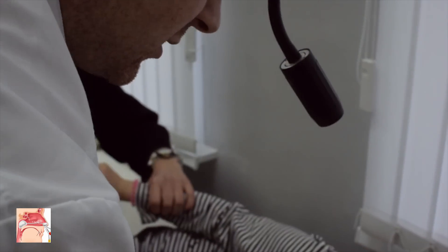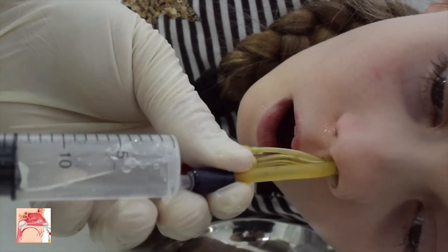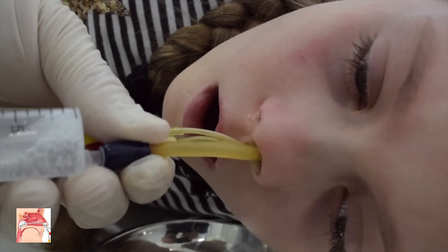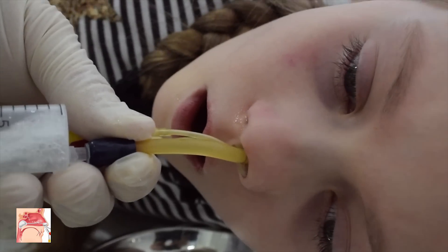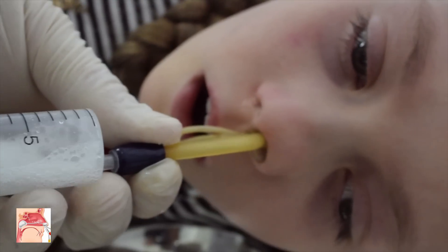For injection of the drug into the sinuses, the patient should be placed in the lateral recumbent position on the same side as the sinuses to be injected. In this position, the drug will fill the sinuses due to a balance of gravity and surface tension. A 20 milliliter syringe filled with 10 milliliters of the drug solution is attached to the working channel of the catheter. The physician begins to move the plunger at a 1 to 2 milliliter amplitude — quite sufficient for the solution to start passing from the syringe into the sinuses, and this small pressure change guarantees a painless procedure.